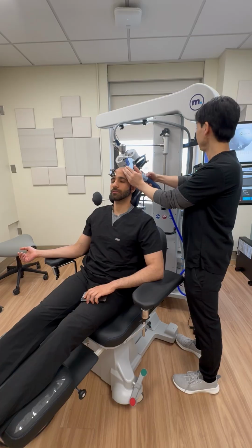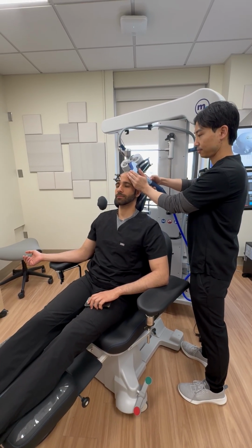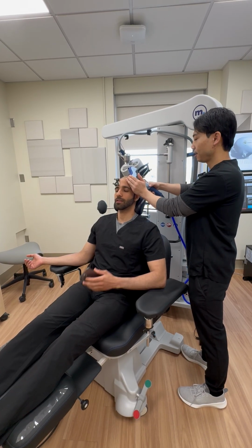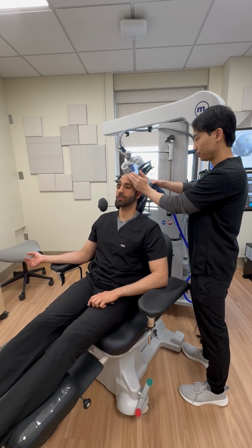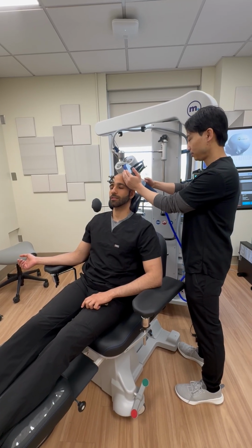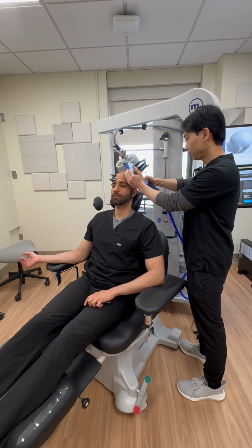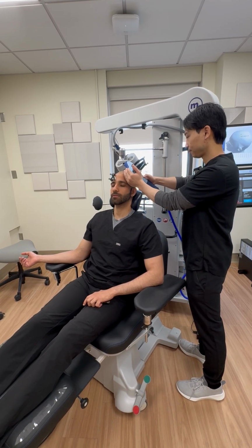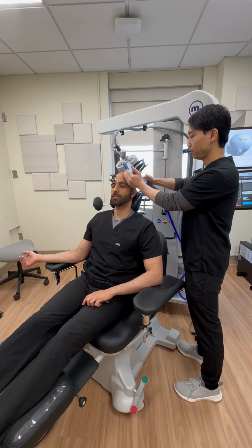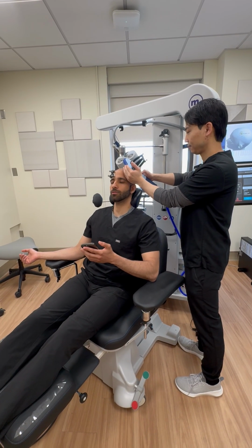So we're going to start at 55. Okay, so we got a response, so we would select yes, and then the PEST calculator would tell us to go down to maybe 48. And then we would do it again. We may not get a response. Let's see. So we'll go down to 48. And no response, so we would go up to 52.